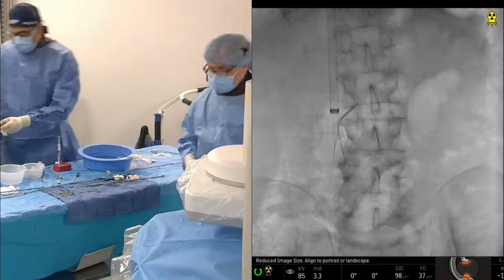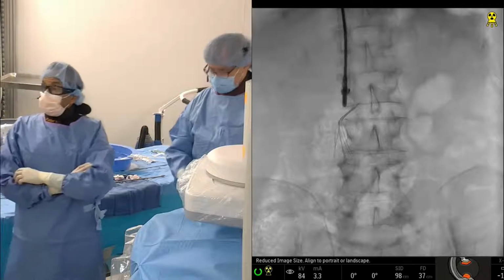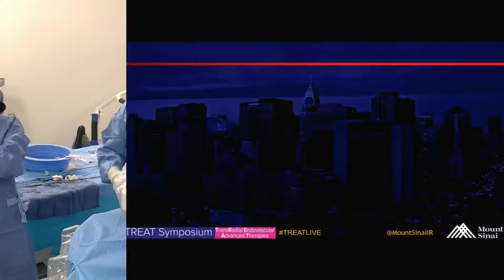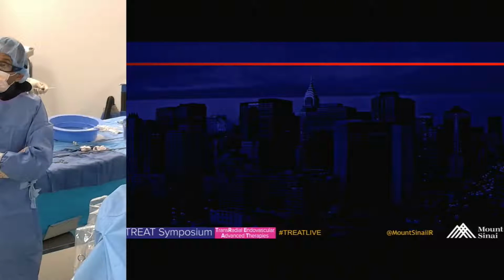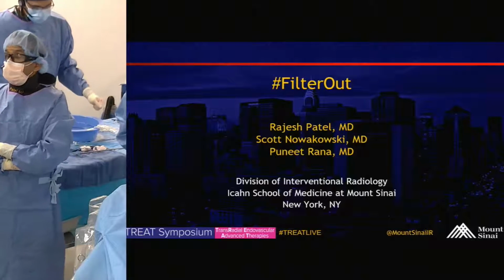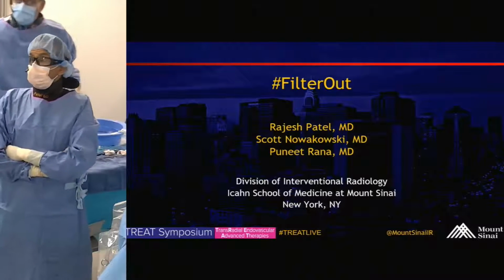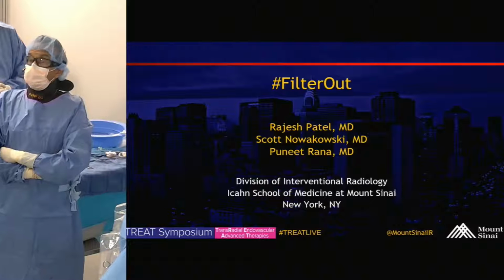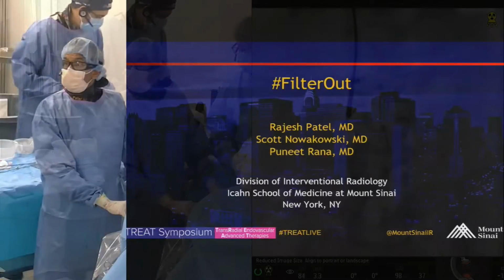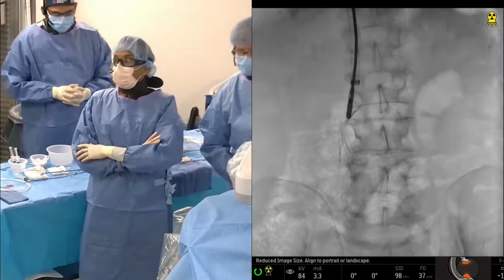Can we just go to the slides for a second? Dr. Nowakowski is now going to be getting our snare in, and you can see our forceps in, and he's going to use that technique of opening up the jaws and then rotating until he can grab it. Actually, why don't we just show the case? I want to get a little closer to the hook there. Yeah, there we go. There you go.